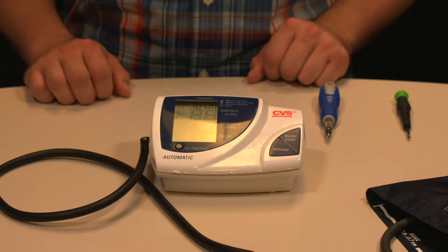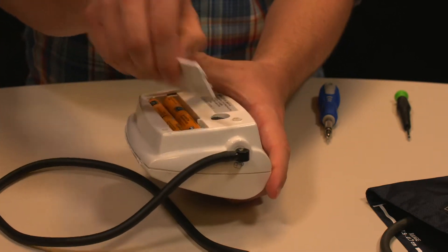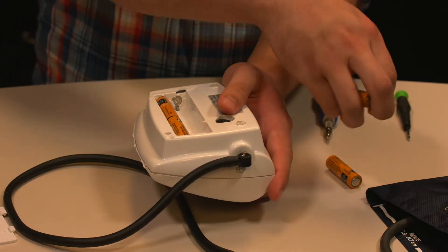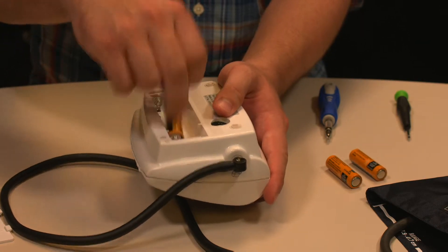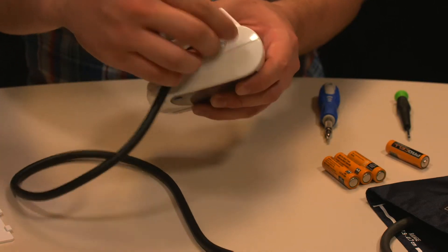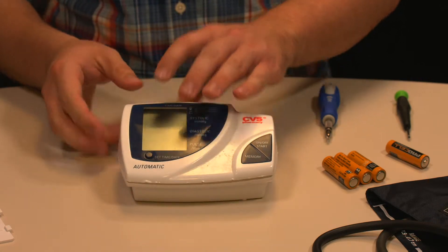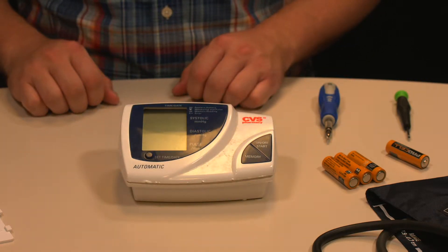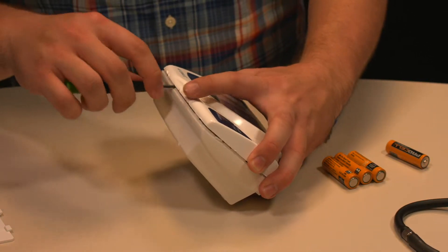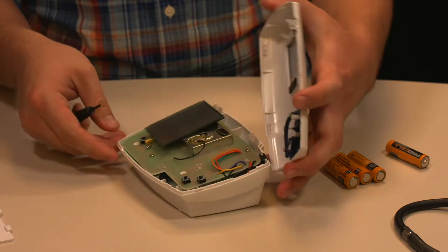The first step is to take the four AA batteries out of the back of the device. The next step is to remove the tubing that connects to the blood pressure cuff. Step two is to take the external casing off, which can be done with a flat head screwdriver — it takes a little bit of work to get off, but if you work at it you should be able to get it.